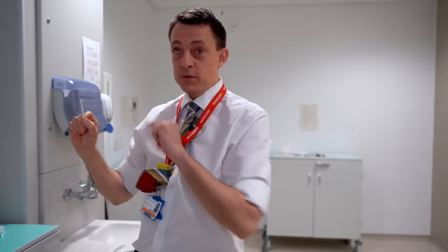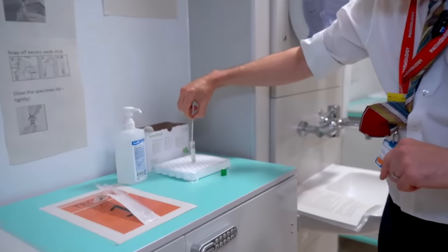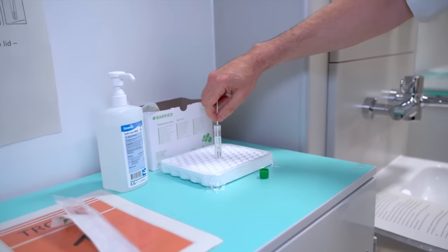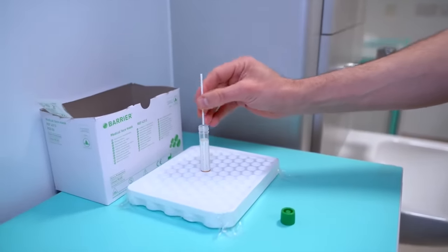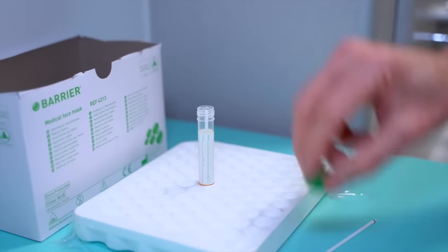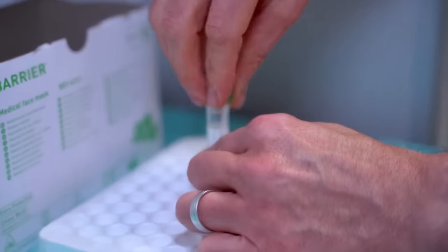With the swab, don't touch the end — lower it into the sample container. There's a black line on the swab that indicates where it should break, so bend the swab against the side of the container and it should snap off. Then replace the lid, turning it tightly.